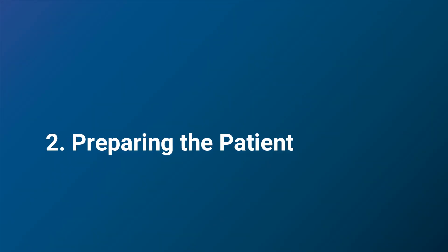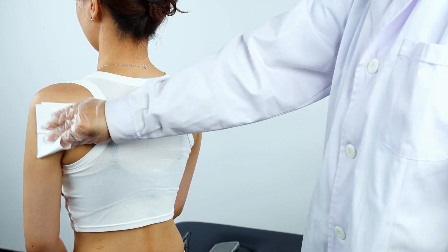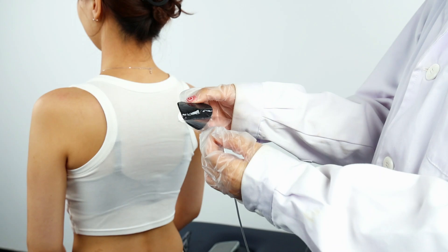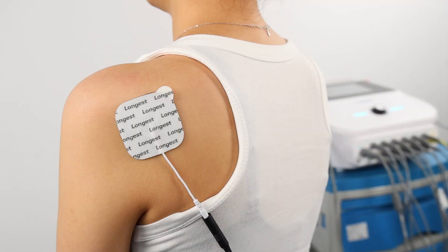After the device is ready, prepare the patient for the treatment. Clean the treatment site with 75% medical alcohol. Apply the electrode pads to the skin, making sure the pads are in close contact with the skin.